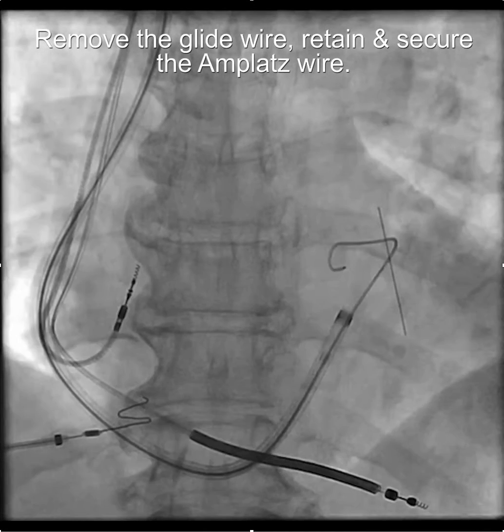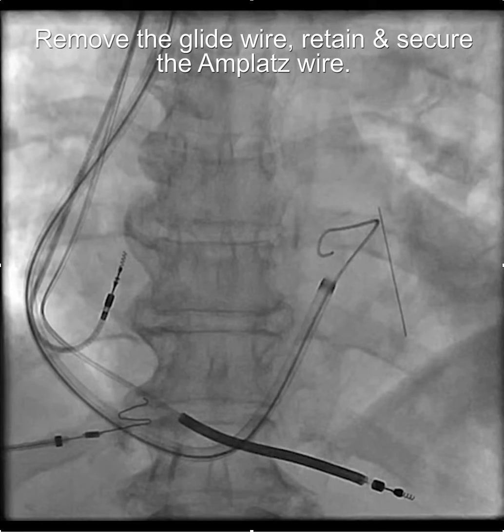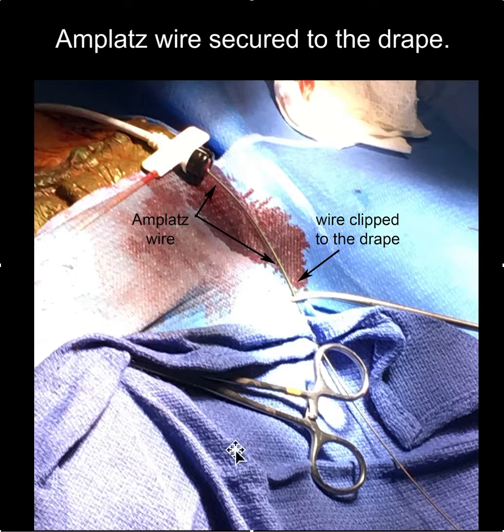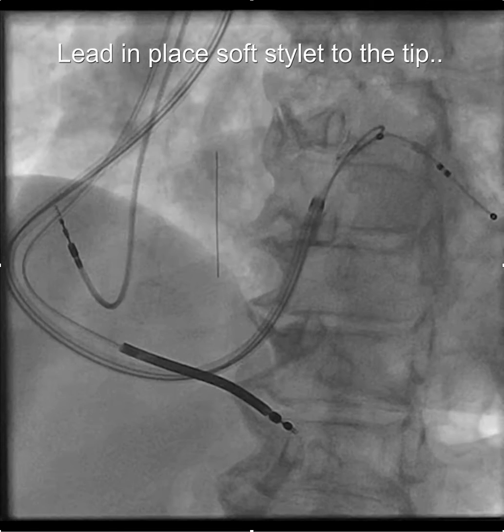Once you get to this point, remove the guiding catheter and the glide wire, but leave one of the amplatz wires in place and secure it to the table so it doesn't come back. One way to do it is to secure the wire to the drape with a clip. Alternatively, if you have a table at the proper elevation positioned perpendicularly to the patient, you can use a large angled clamp, clamp the wire, hang the edge over the table edge, and put a towel on it to stabilize the amplatz wire.